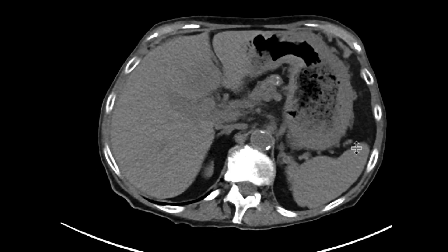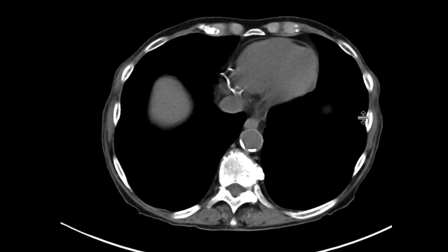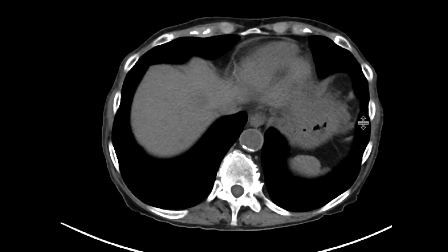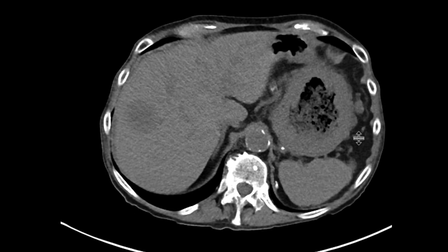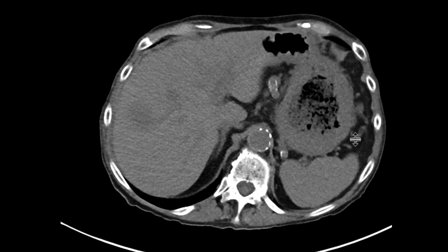This could certainly be a primary gastric neoplasm with liver metastases. However, given the history of renal transplant, one needs to think about post-transplant lymphoproliferative disorder.